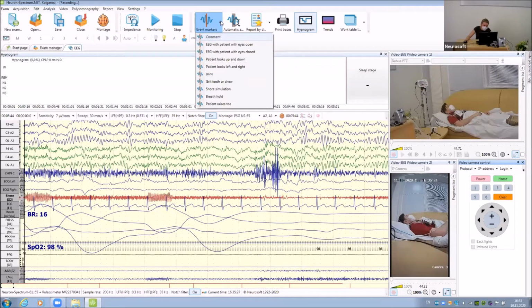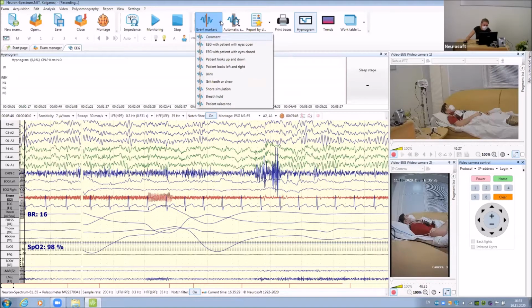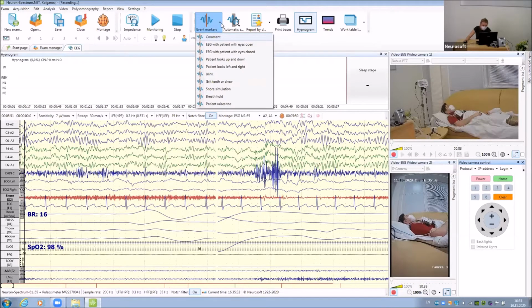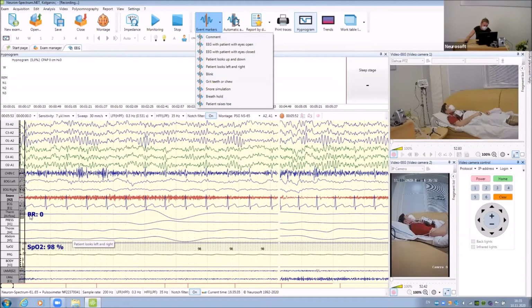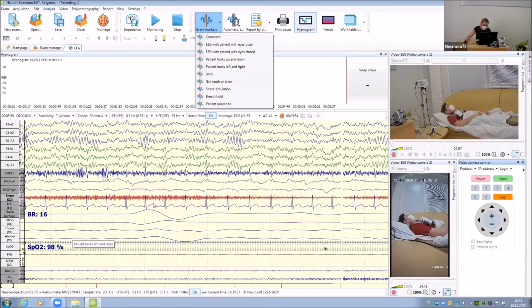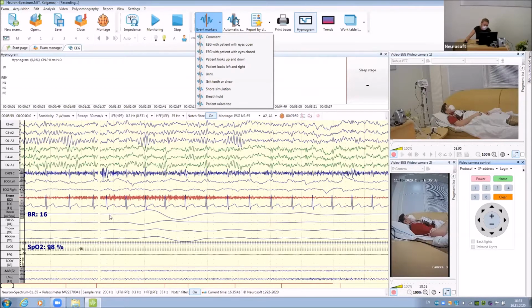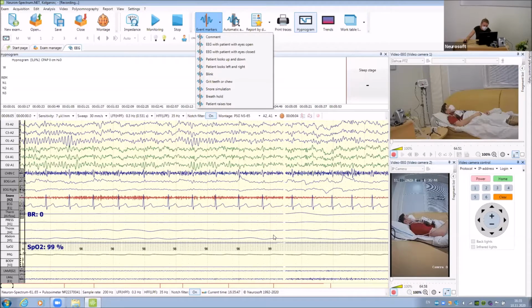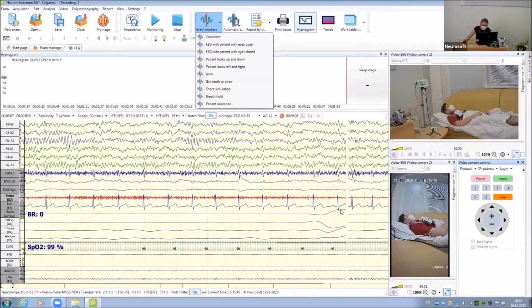Okay, now thank you. And now we ask our patient to hold the breath. Anton. Here we see a wave, and now we can see only a line without a wave. Thank you, Anton. You can continue to breathe.